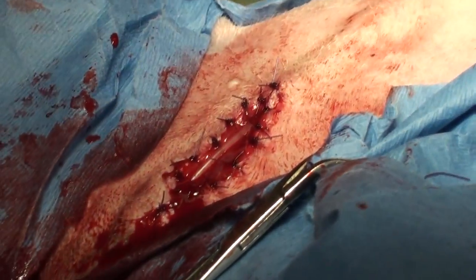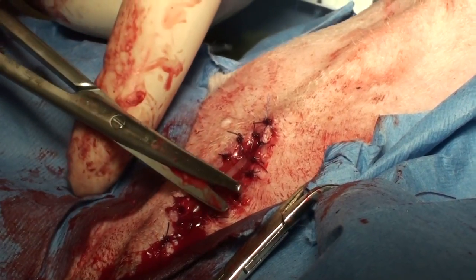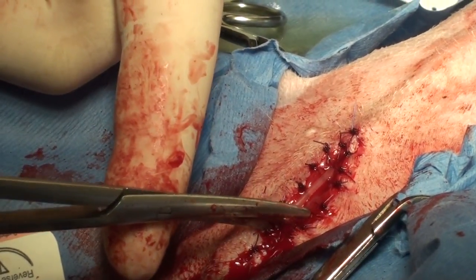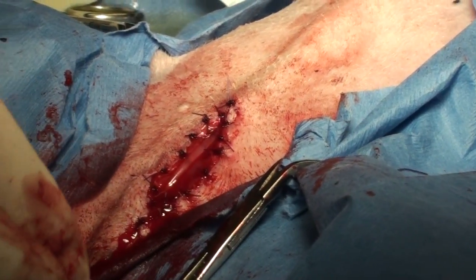This is what you need to do when you get old and can't see anymore — I can sure see better with magnification. I've sewed up the whole urethra to the skin. You can still see the catheter, but now you see the urethra spread wide open so that any stones in the urethra can come out easily. We're going to trim up some of the ragged edges of the suture so it doesn't bother our patient — you want them long enough to pull out, but not too long to irritate the incision.